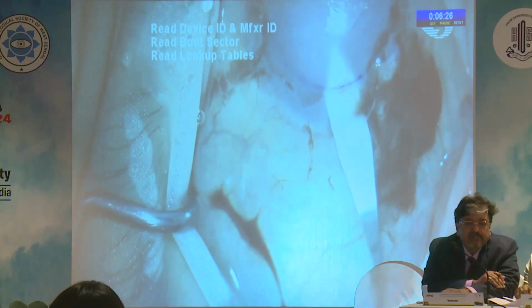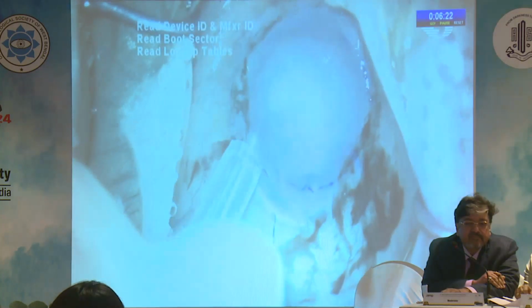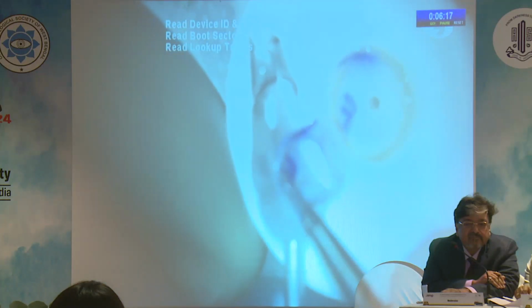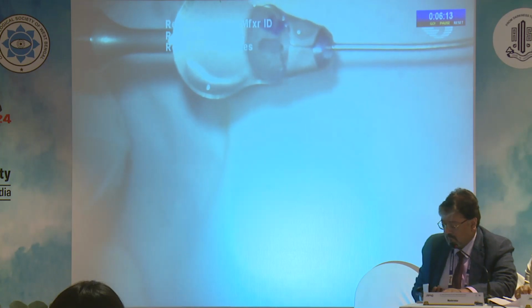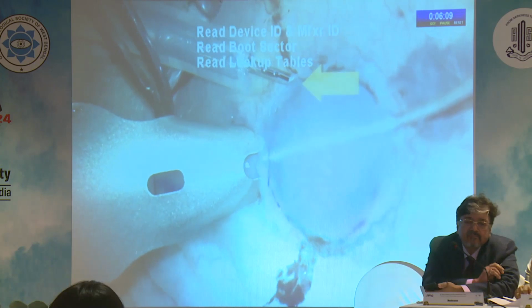Incision is made and viscoelastic is washed. An AC maintainer is instilled. We use the pull-through technique with the Busin glide to insert the donor lenticule. As we are pulling the lenticule in, pay attention to the AC maintainer.